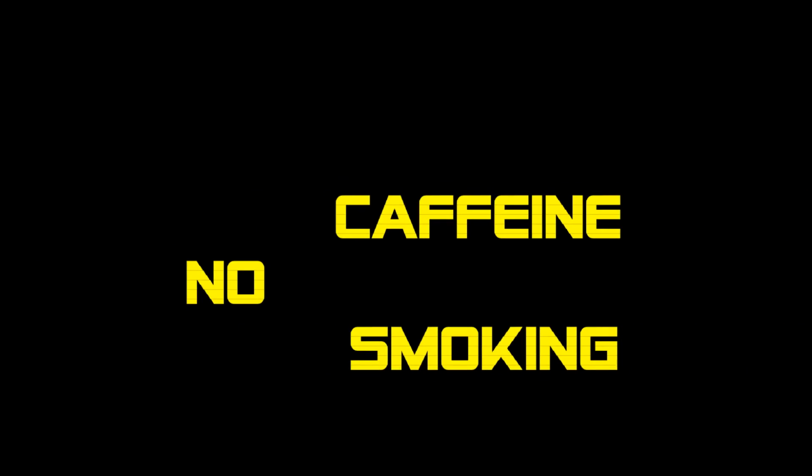This video will demonstrate the proper procedure for the assessment of resting blood pressure. Patients should be seated quietly for at least 5 minutes with proper back support, feet flat on the floor, and their arms supported at heart level. It is important to note that the patient should refrain from caffeine and nicotine 30 minutes prior to assessment.